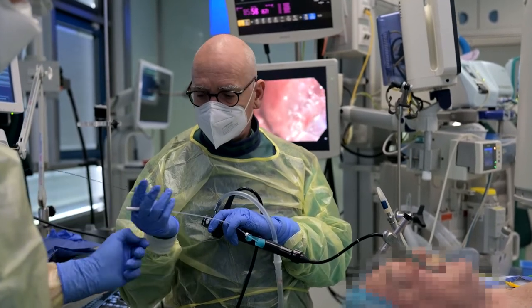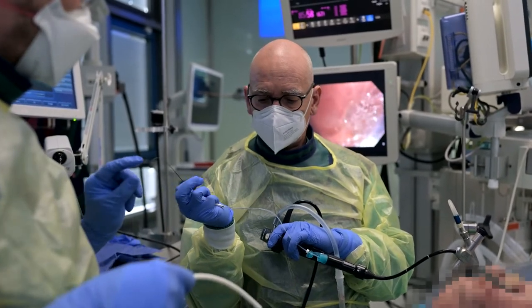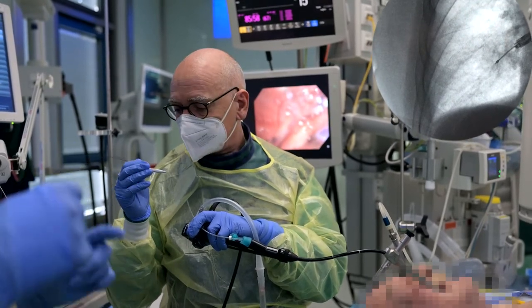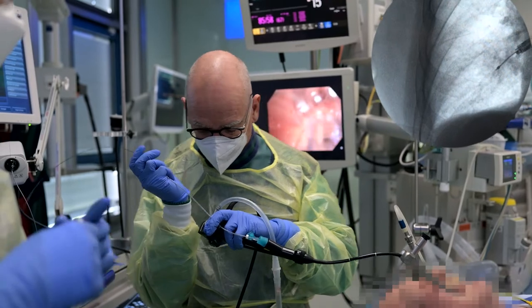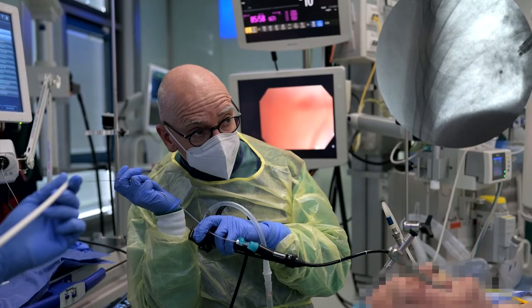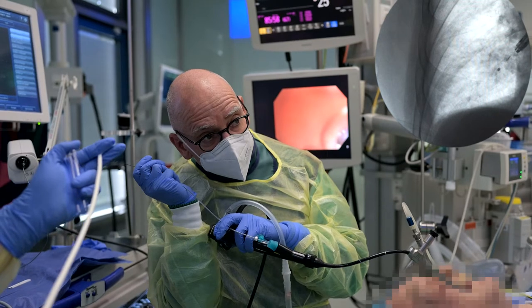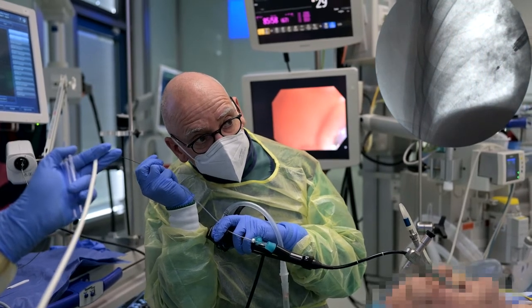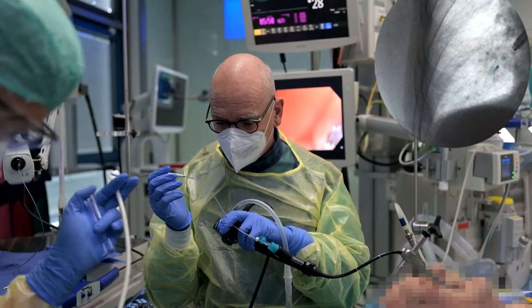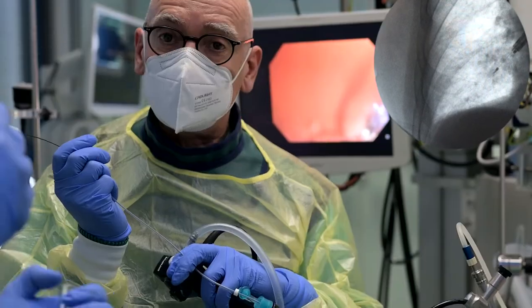The flexible single-use 1.1 mm cryoprobe is inserted into the guide sheath. Fluoroscopy is used to bring it into the exact same confirmed position of the radial E-BUS probe in the lesion — advanced just as far in relation to the fluoroscopy marker of the guide sheath as the radial E-BUS probe was before. Significant guide sheath deflection can be prevented by using the flexible single-use 1.1 mm cryoprobe. Once the cryoprobe is in position, freezing is activated, in this case for 11 seconds.